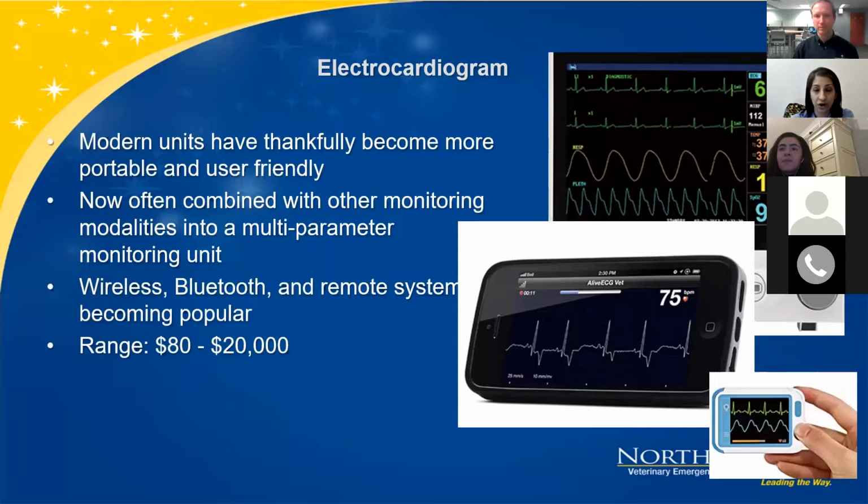They can range in cost anywhere from less than $100 to, at the higher end, a high-end multi-parameter monitor in the several thousands of dollars. An ECG alone unit is probably a reasonable, moderate cost.